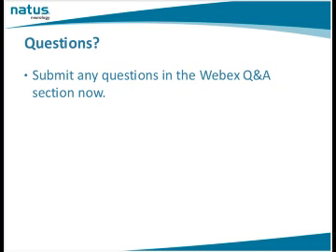And then the other thing that I think, this is such an important question. I can't emphasize enough, we teach a technique. If you do that maneuver, so for the PCA, for instance, from the bifurcation, you're tilting posterior and inferior. If you don't get it the first time, try it again, maybe a little less or more posterior, a little less or more inferior. But if you do that maneuver that you've learned and you don't find the PCA, you need to put in your notes, unable to positively identify the PCA.